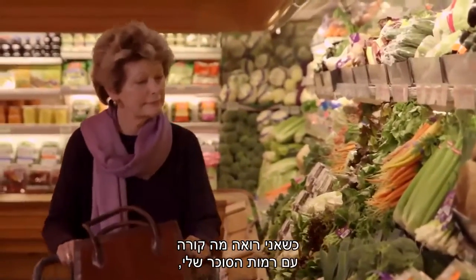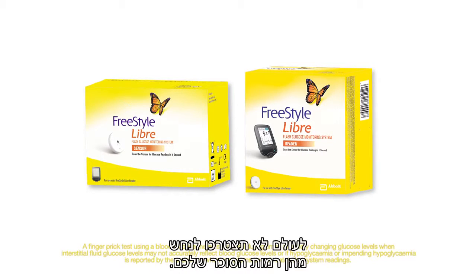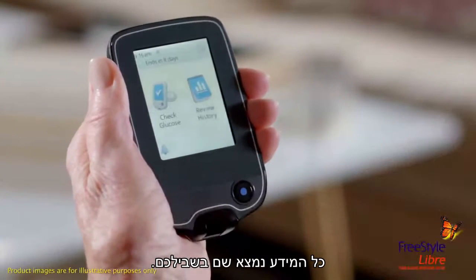When I can see what's happening with my glucose levels, I can do something about them. With the Freestyle Libre system, you never have to guess about your glucose levels, and you never have to guess what the system's doing either. All the information is right there for you.